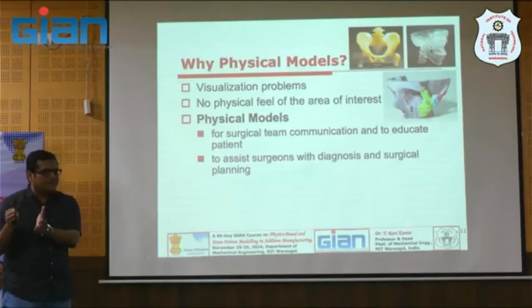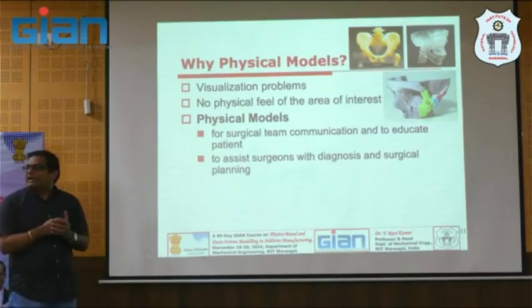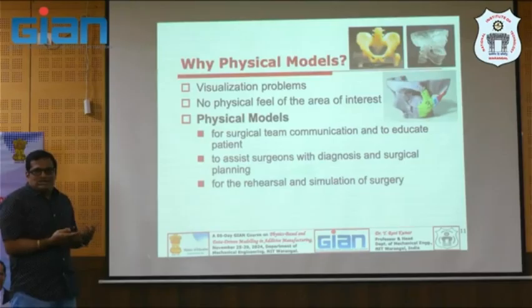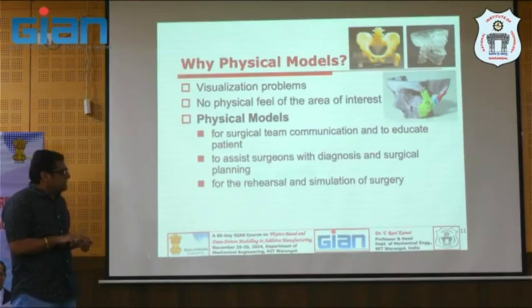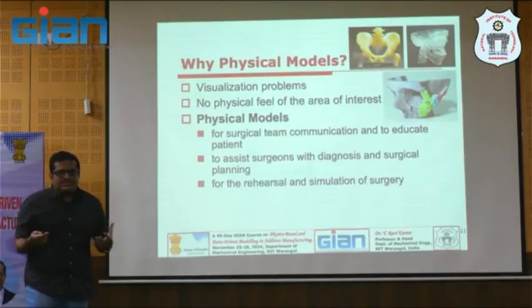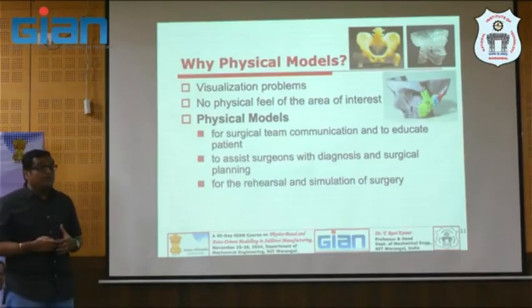Maybe that's the first level of application of any medical AM printed model, just for diagnosing, depending. Or we may even need to do a rehearsal of the surgery on this model, so he or she should not do it on the patient in real time. They can do a lot of rehearsal and a lot of simulation, or they can come out with the best or optimal surgical procedure, which may not have existed before. So that is possible.